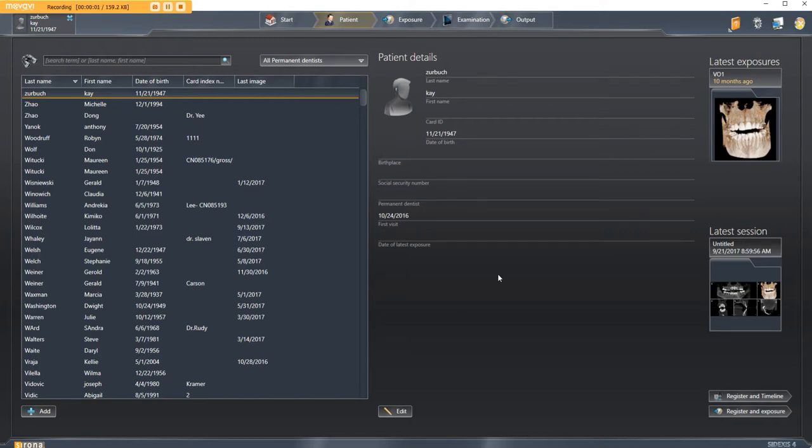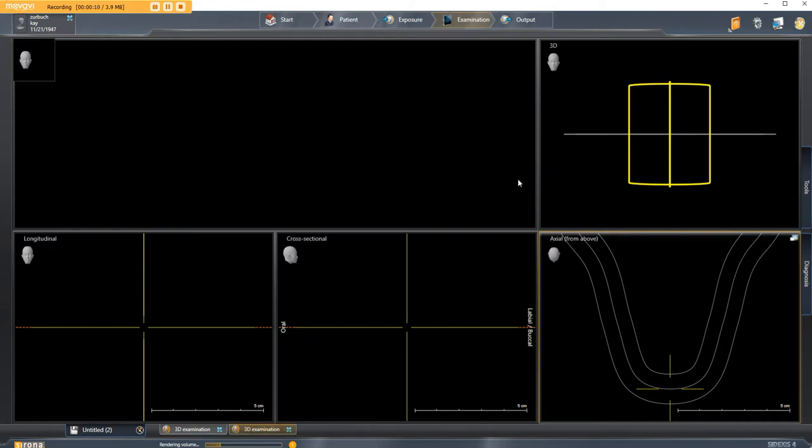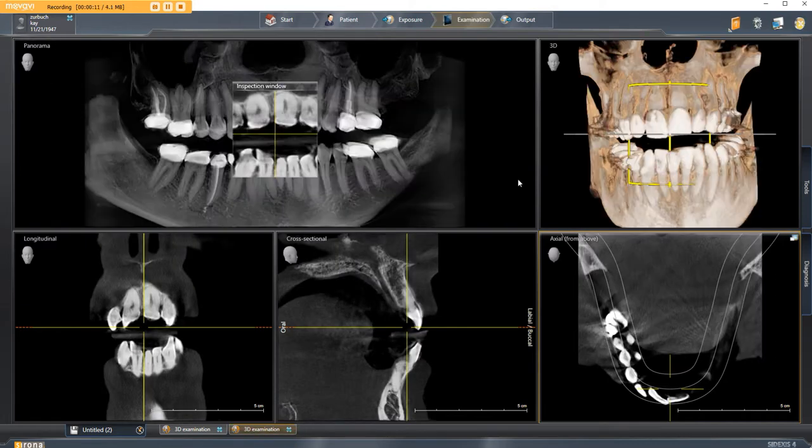This video will explain how to export DICOM from the Sodexas 4 software. The first thing to do is find your patient, double-click on the right corner to pull up the 3D view, and then you click Tools.